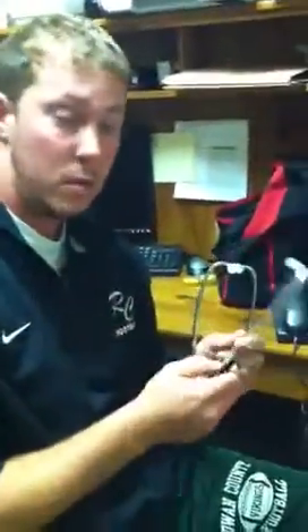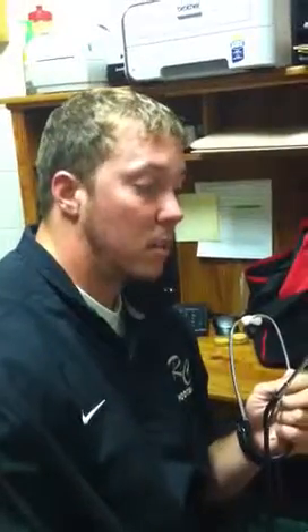The stethoscope we have right here has two headsets. Since Ms. Pennington is a nurse, she will actually be able to listen and hear what I am hearing at the same time. This will clarify if I'm getting the accurate reading and that we agree on what the reading is. If I get something like 120 over 80 and she gets something a little different, we'll rest a minute, let her relax, and then after about a minute to two minutes, we'll do it again to confirm we get the exact same reading.